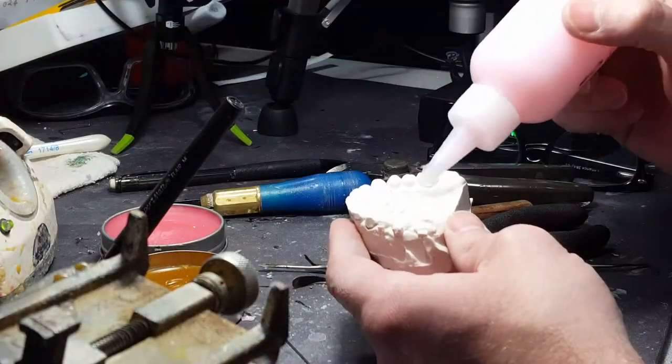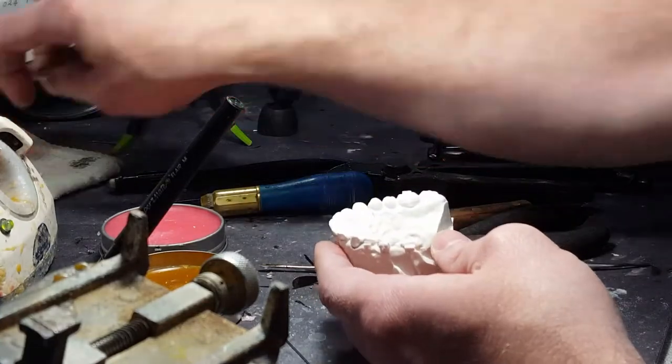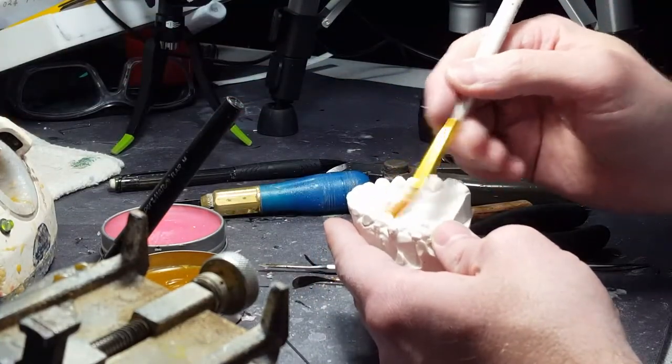So I've already painted it once. I'm going to put one more coat of separator on before I start bending. This will be my second coat.